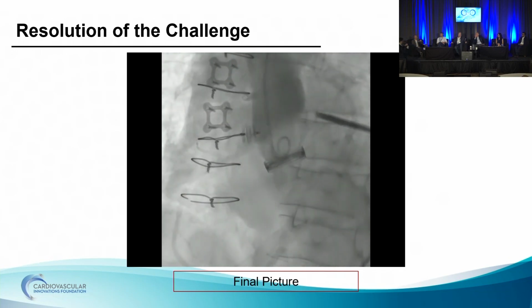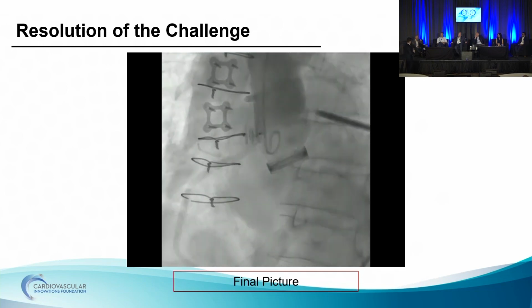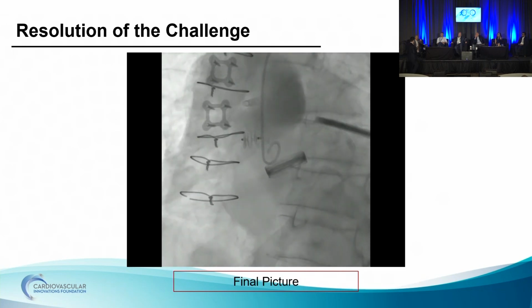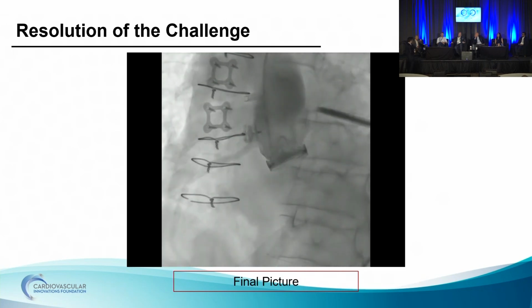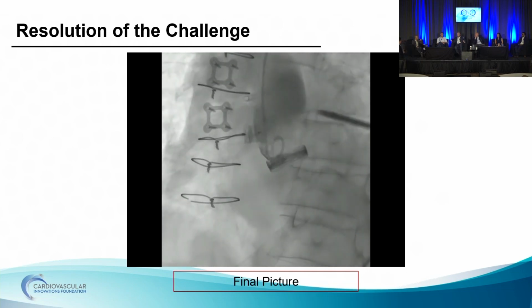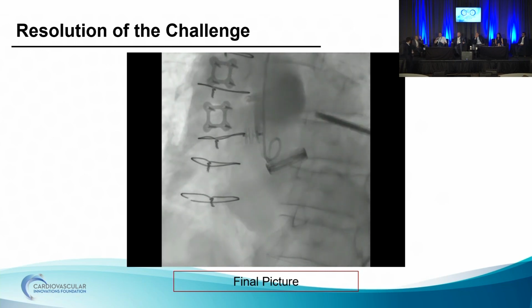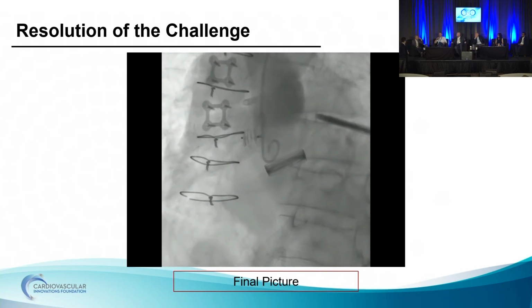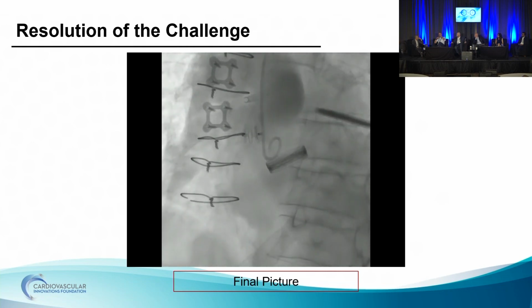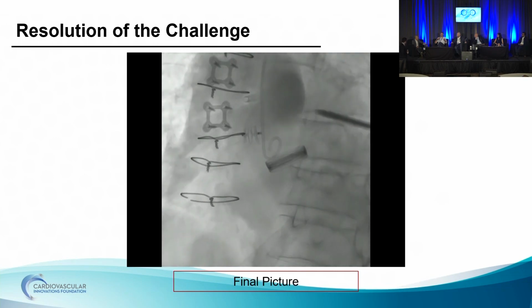My question is, if you used an ASO with a covered stent, would you have felt there's a risk of displacing it, since you only have 1 disc on the one side with the stent? No, I think usually, if you size it right, it should sit there. The ASOs work generally well for this context. It's just what the surrounding structures are. It was about a 6 millimeter, so the waist would be 6, and then plus 10 probably on each side, so you're at 16, and the disc is 10, that might be too big. I think you guys did a great job.